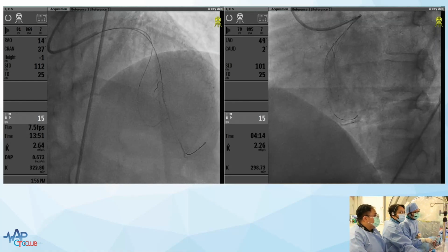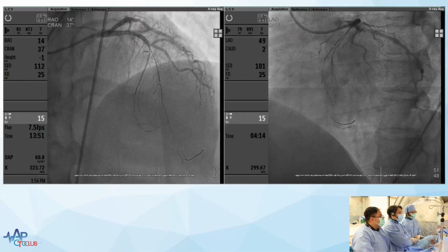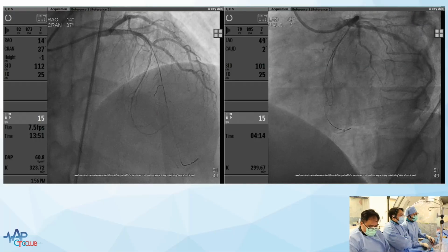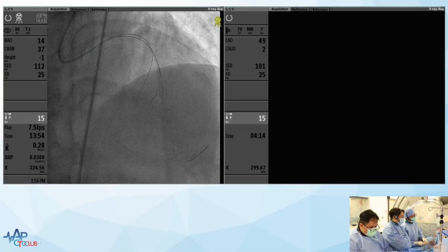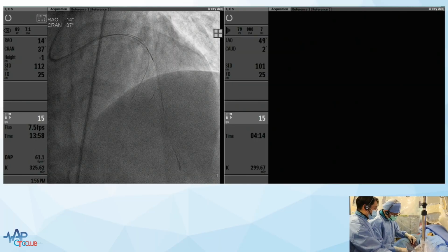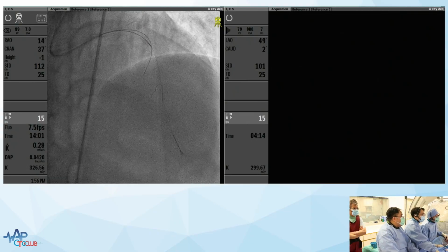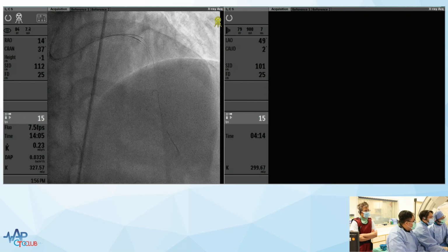Okay, channel looks intact. I don't think there is any problem. So we should follow Wataru's advice and remove the retrograde gear, right? Yes, remove the retrograde gear gently. It's a Suoh, so it'll come through without any problem, I think. This is why you want to switch to a Suoh, because if you pull UB3 through a tortuous channel, you can damage it again. That's very nice. Good.